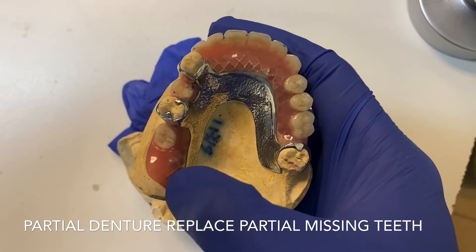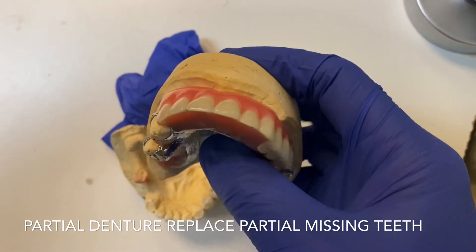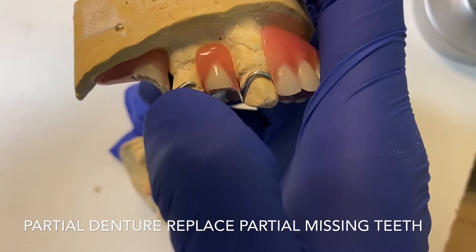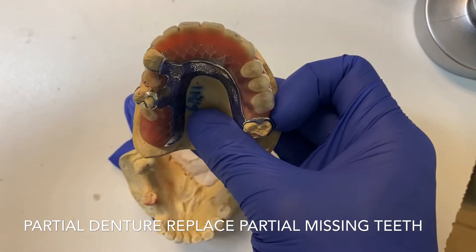There are several ways to offer a patient a replacement option. This is one way — the partial denture usually has a metal hook like this, and this is how you use your finger to pull it down and take it out.